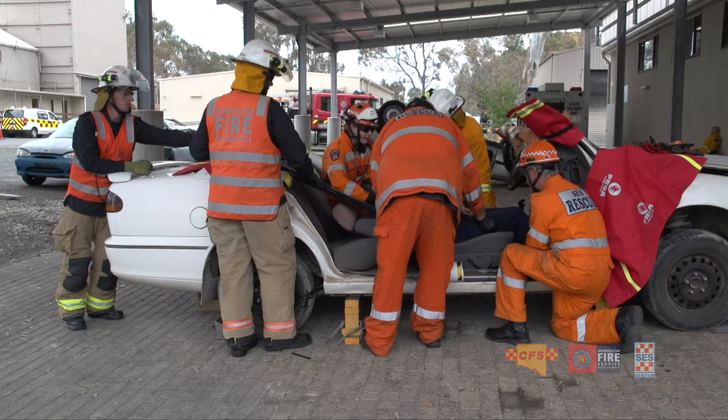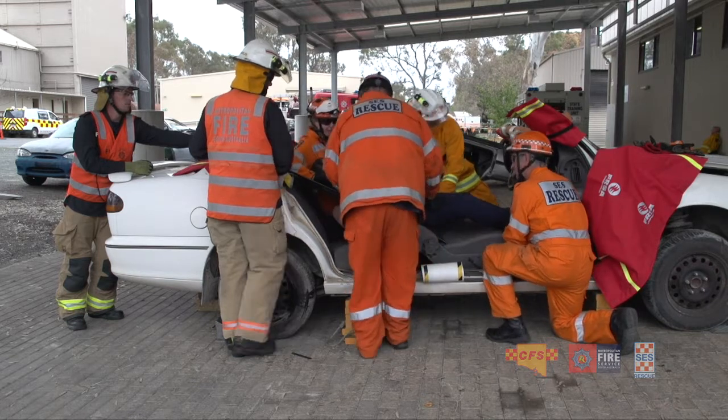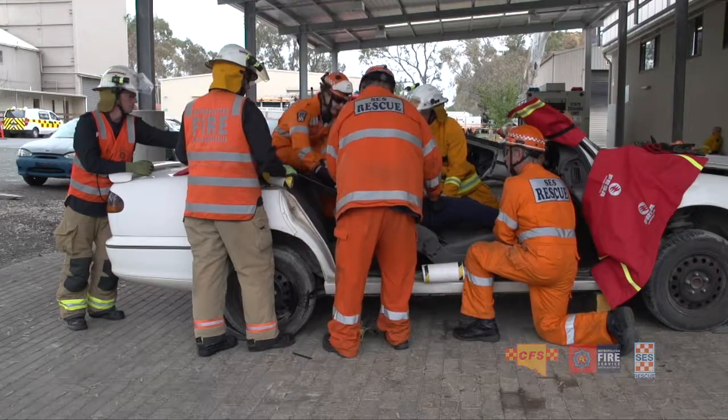The crew member at the head of the casualty must take control of verbally calling when to slide the casualty up or down and how far. For example, ready to move 300 mm. Move. All crew members will follow that verbal call.